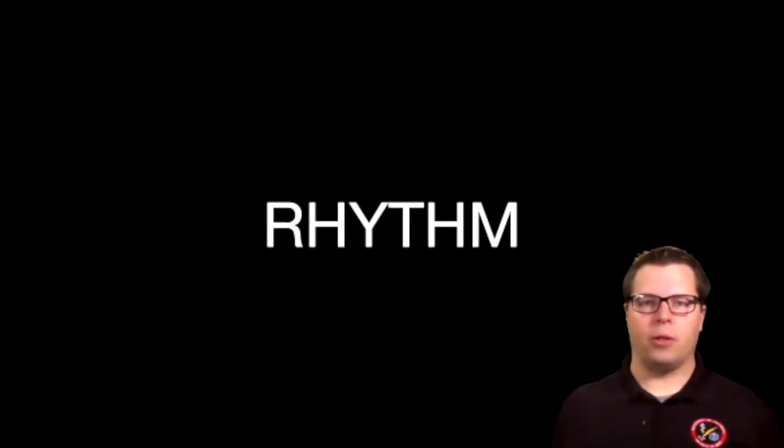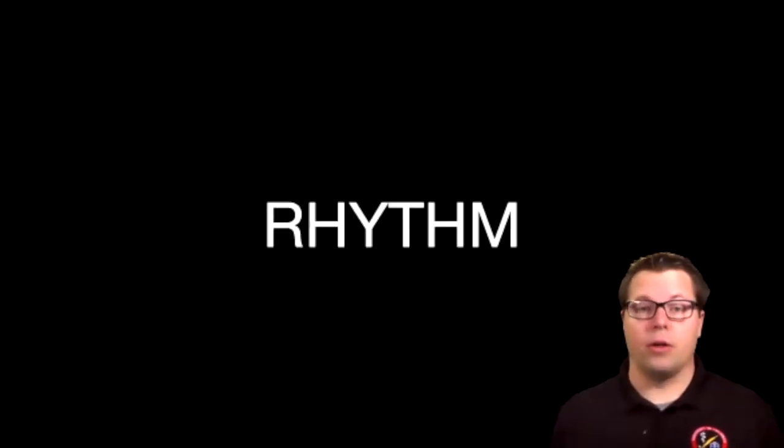All right. Rhythm. We talked about the rate. Now let's talk about the rhythm itself. There are basically some questions that you need to answer here. And that is, are there P waves? If there are P waves, is there a P wave before each QRS? And is there a QRS following each P wave?